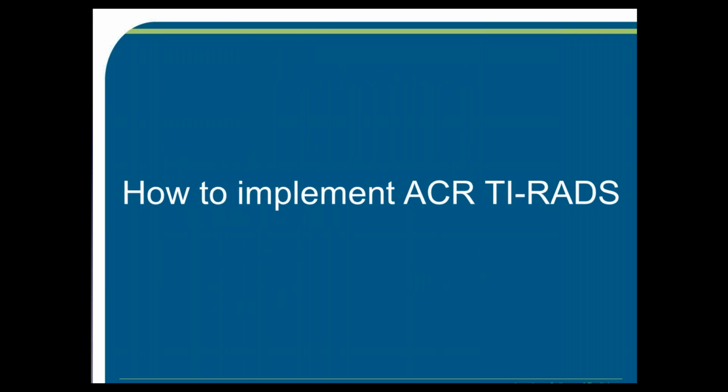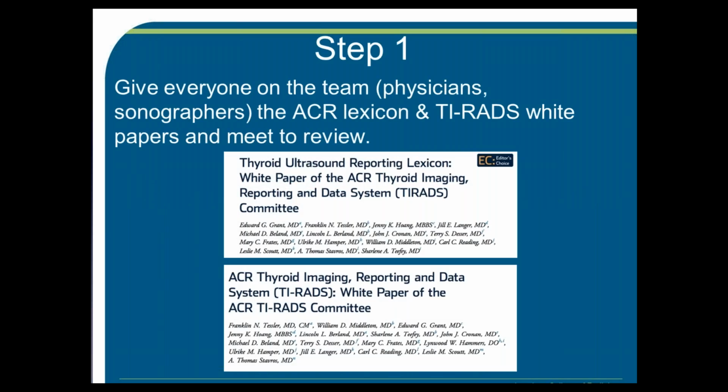Finally, I want to close with a few points on implementation of ACR TI-RADS from a practical perspective. First, I think it's valuable to give everybody on the team, including physicians, sonographers, or whoever else may be involved, the ACR lexicon and ACR TI-RADS white papers, and then meet as a group to review, so you're all on the same page in terms of what you're doing and how you're describing things.